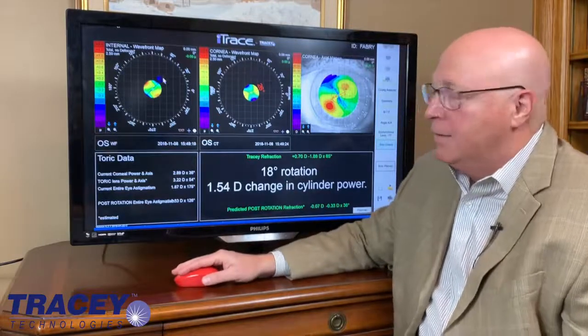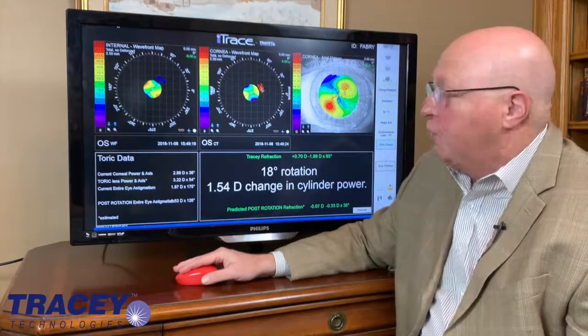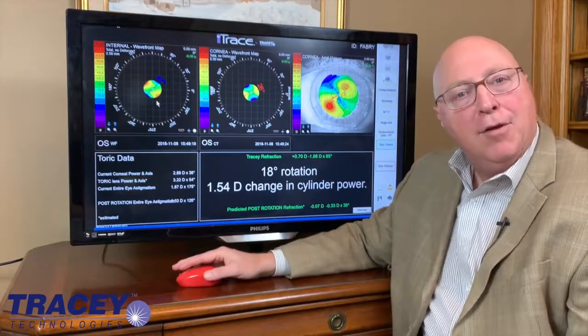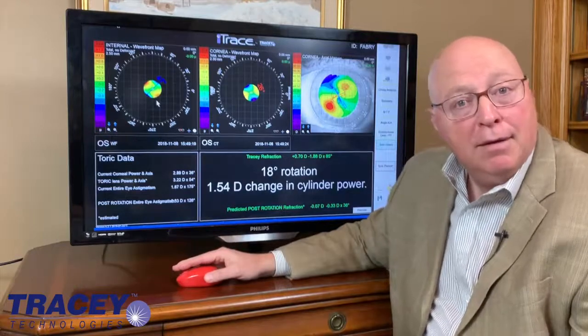The doctor says that lens needs to be at 43. It's only off 4 degrees. Your machine is wrong. It shouldn't be 26. I put it right where I wanted. Well, let me ask you the question then, doctor. Is the patient happy? No, they're not.